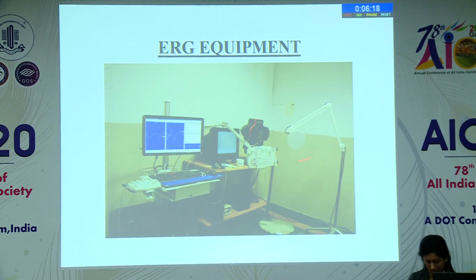This is the stroboscopic lamp for flash stimulus. This is a monitor for pattern stimulus. This is Ganzfeld stimulator, and this is the preamplifier, and this is the oscilloscope.